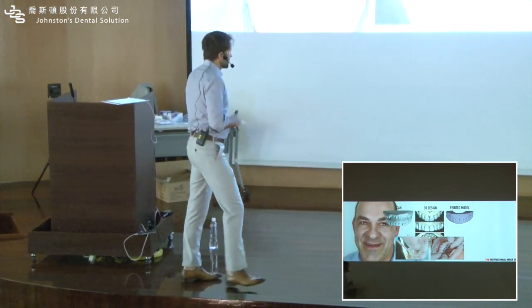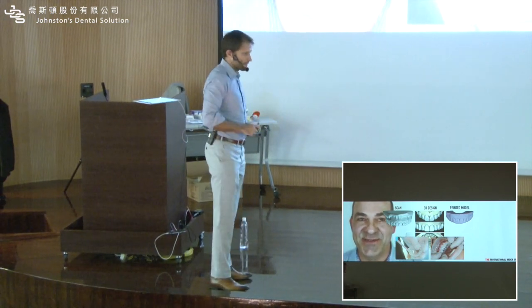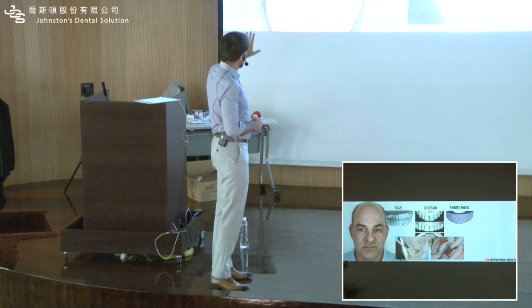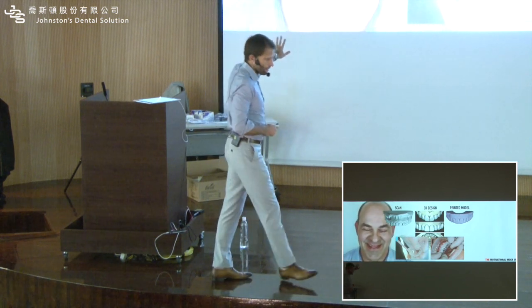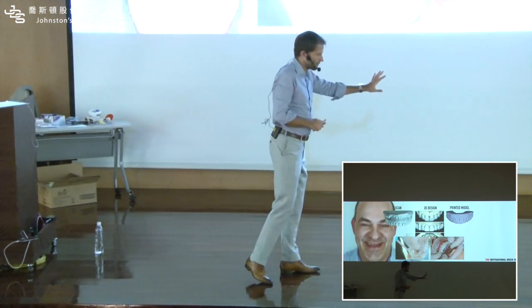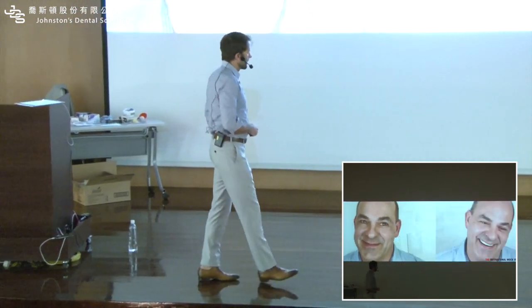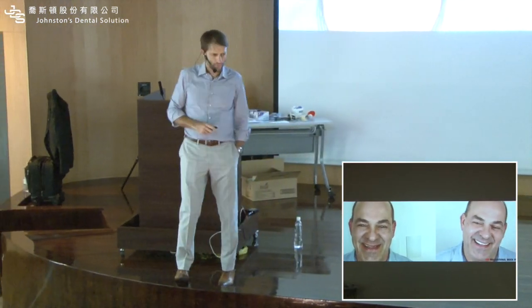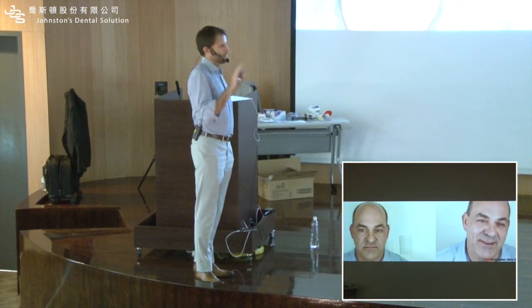So, okay. So you click the mock-up in the mouth. It takes a minute to do that. And you take a video with the phone from before. You put it in the mouth. You take a video with the patient with the mock-up. And in 5 minutes, you present this to the patient. So the patient is like, wow, this is amazing.